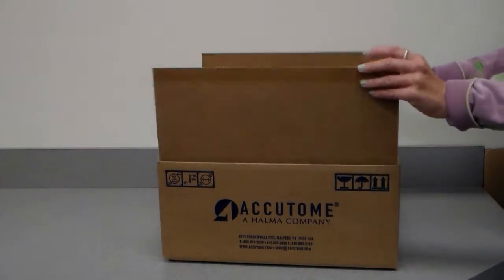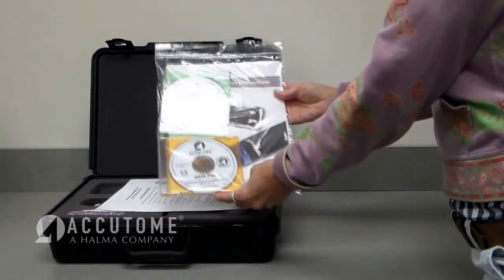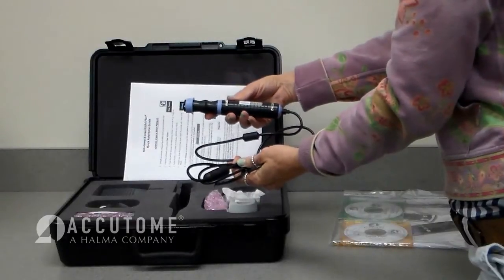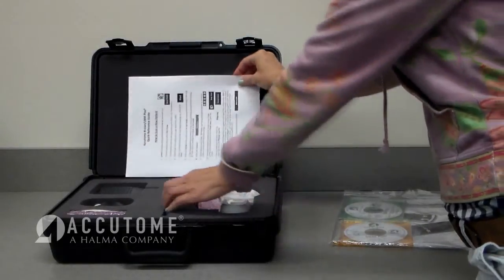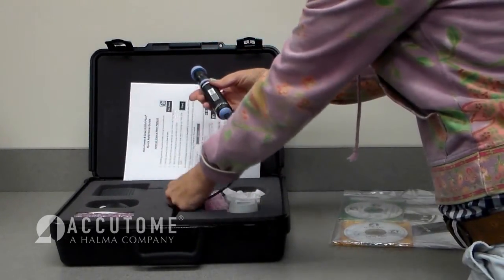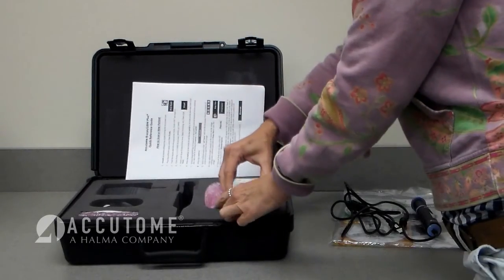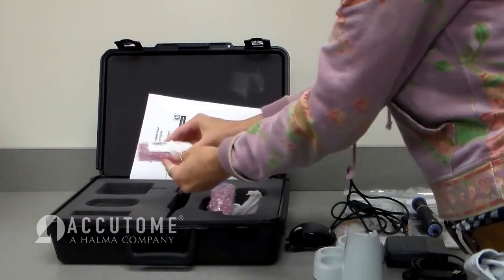Opening the box: when the UBM Plus first arrives, open the shipping container. Remove the literature packet and UBM from the carrying case. Inside the carrying case you'll find the installation instructions, installation software, UBM Plus probe, probe holder, foot switch, mouse, scleral shell, and quick reference guide.